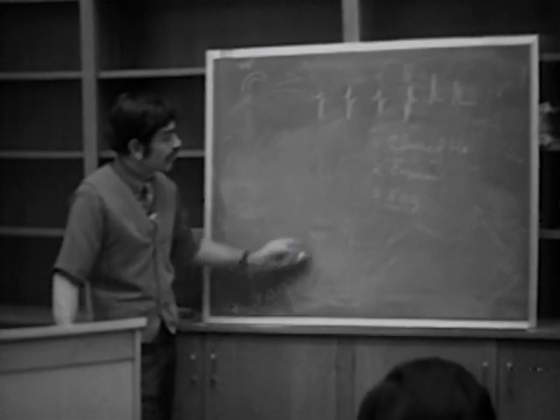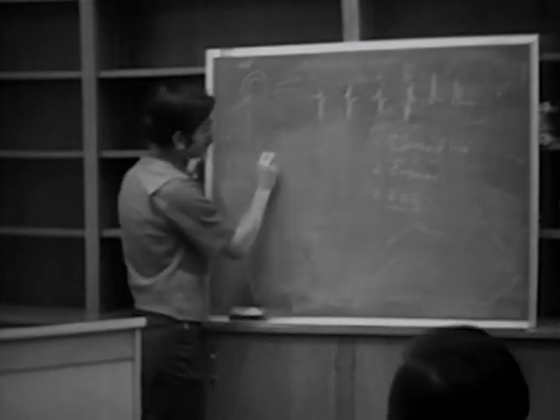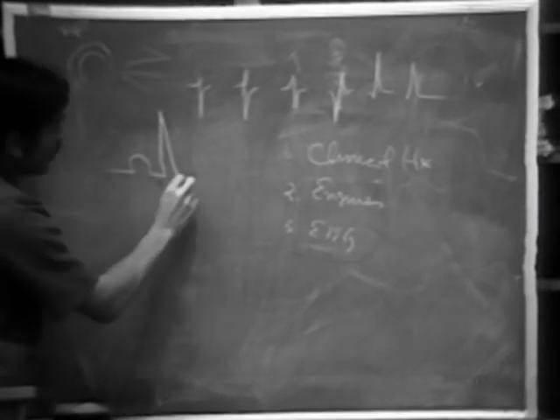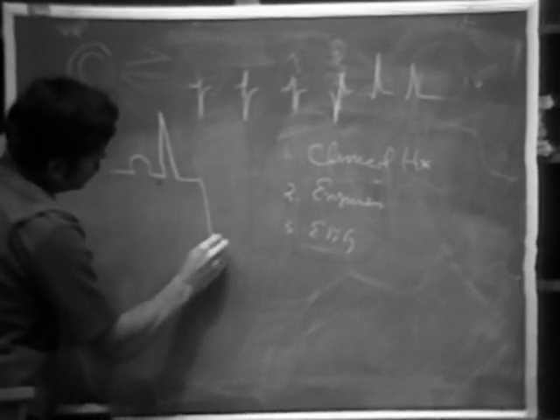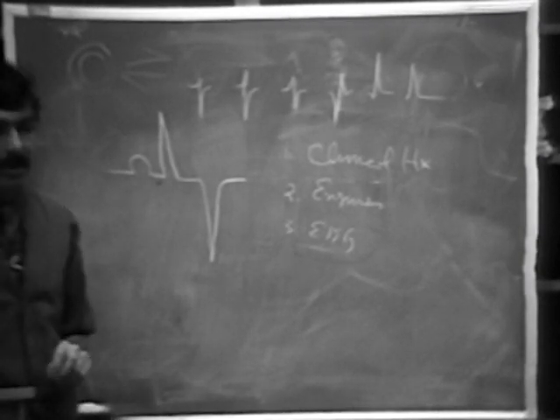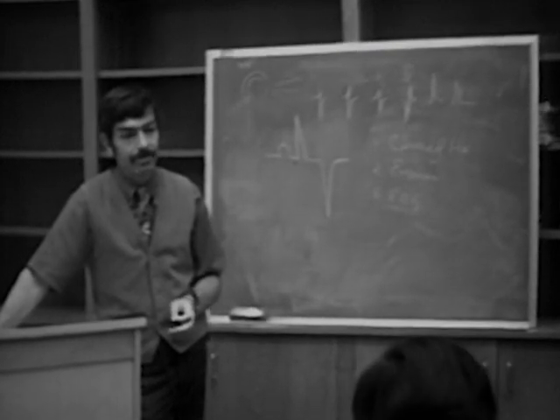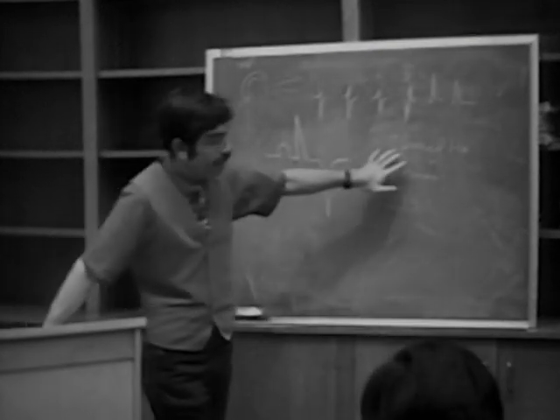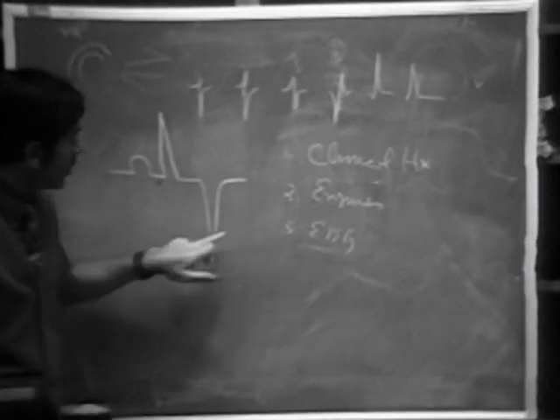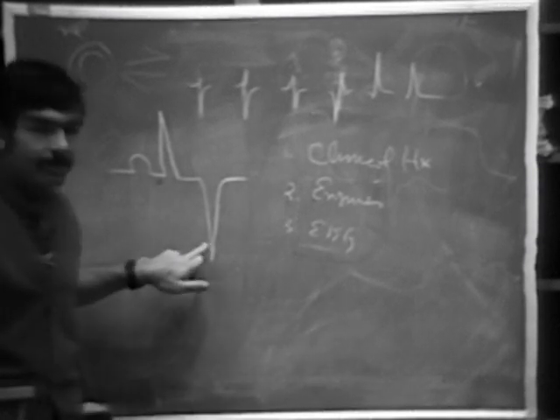Okay, but this is the typical change that you get with an acute intramural infarction. You get no Q waves, and you get your Pardee T waves. They may be located on the inferior surface. More commonly, they seem to be located on the anterior surface. So if a patient comes in with a classical history of terrible chest pain, he has a typical enzyme rise, and you see this change on the electrocardiogram, and this change has to persist.